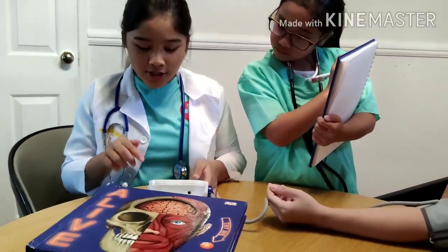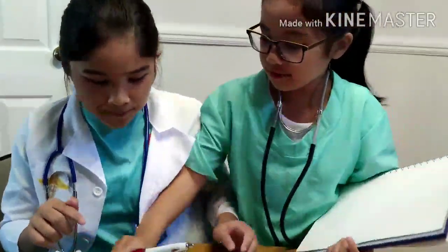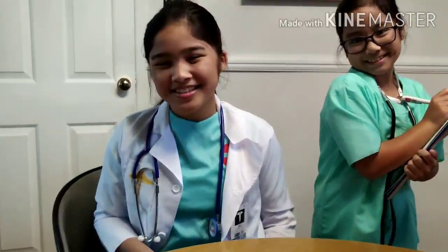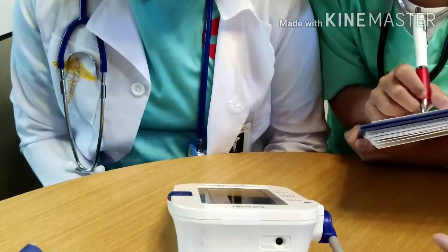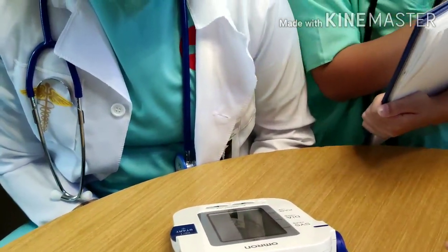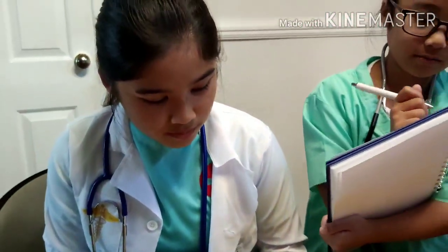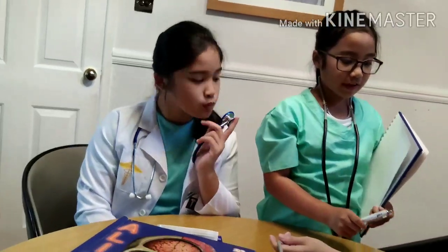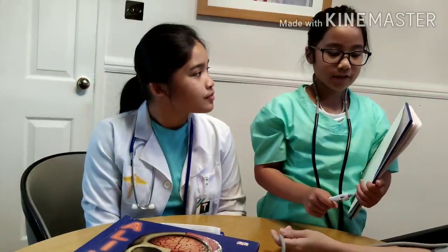Press the button on the monitor to start it. Now it's doing the counting. It may be tight, but that's normal. After pressing the start button, the cuff will inflate, but it will feel uncomfortable because it will tighten your arm. But after that, it will deflate and then you'll be fine and it will be done.